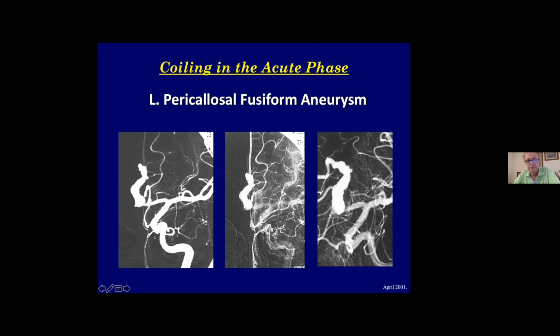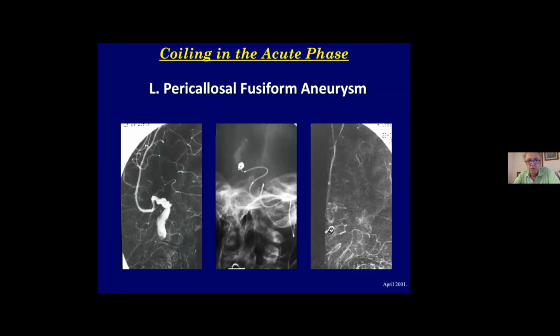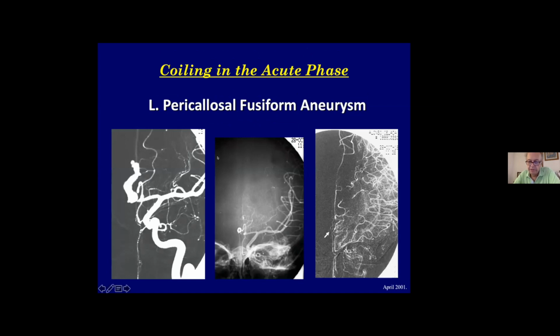And I decided to put coils and test occlusion with coiling. At this moment, I see the contrast stagnation, the contrast inside the aneurysm.